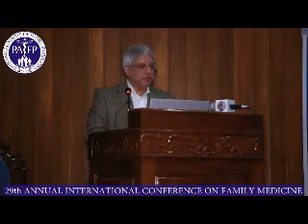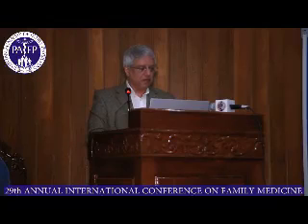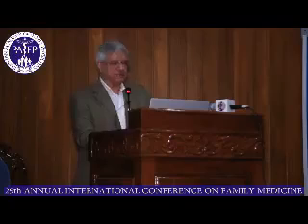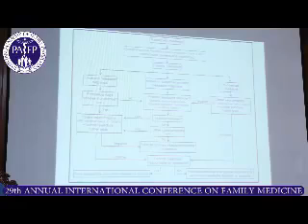Now this is the table which I was referring to, why MR is preferred over CT and where there's a draw between MR and CT in these circumstances. You can see that for vascular diseases, MR is preferred. Same stands true for neoplastic diseases.